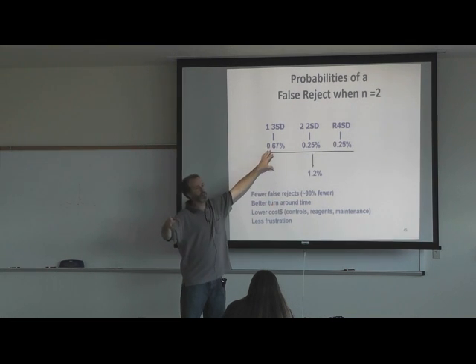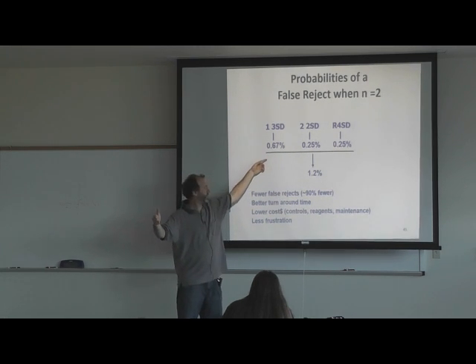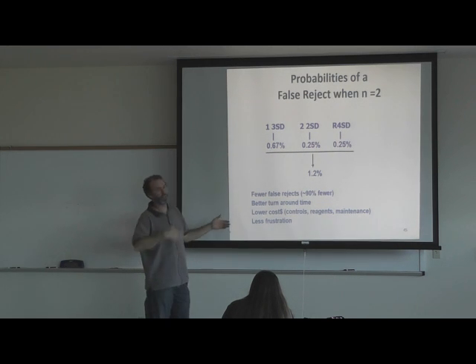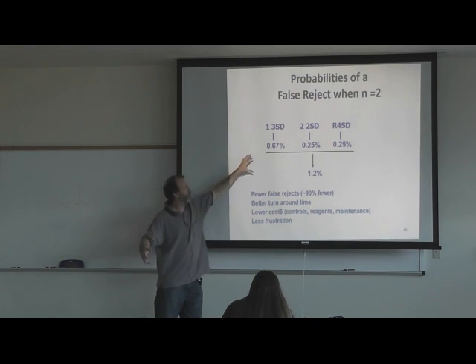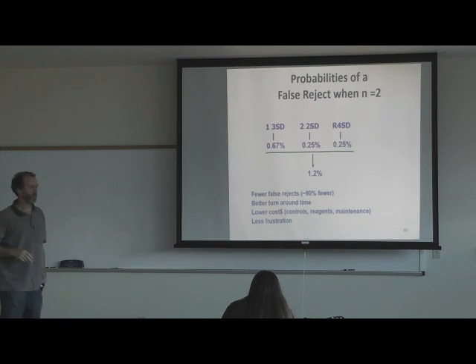So they use these rules rather than just the 2 standard deviation rule because you have good detection with fewer false rejects, which saves the lab money and gets the results reported faster. So you don't have to rerun patient samples when there's nothing wrong with your machine. So that's why they came up with these rules. Does that make sense? Muddy water.